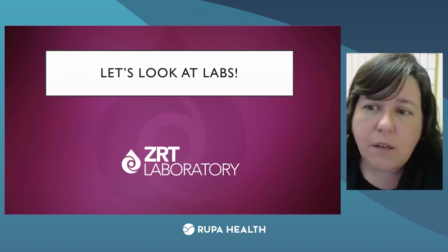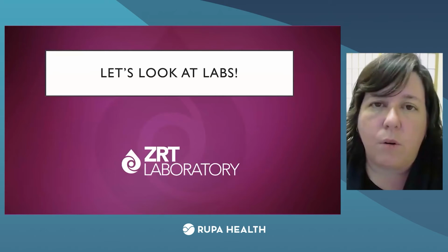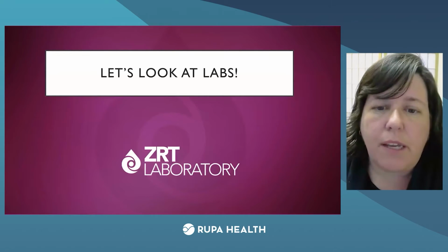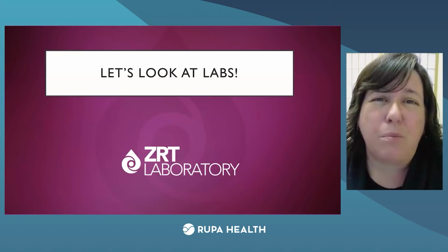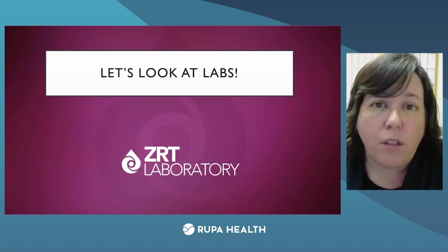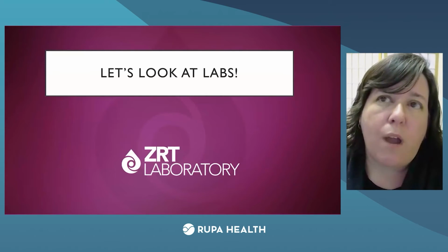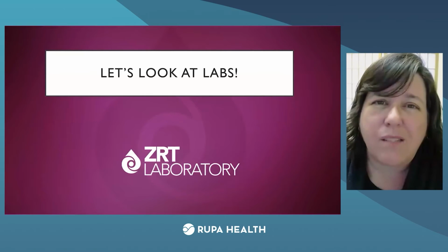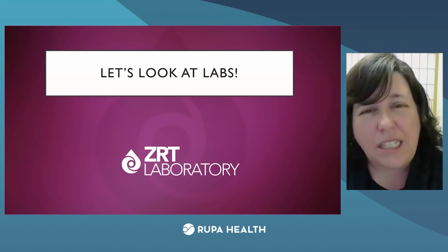So reverse T3 is a question that I get asked a lot. There is very little hormone in a blood spot. So the problem with reverse T3 is there's very little of it there. When you get to a blood spot, it's a little bit of a volume, but it's also the levels of detection. So right now, the way you have to do reverse T3 mostly is radioactive immunoassays, which we don't do, or you can do it by some LCMS. It's very little is in there.